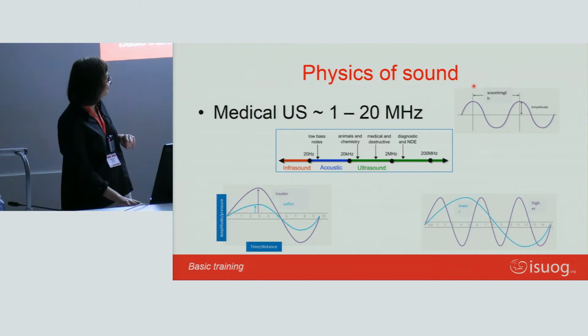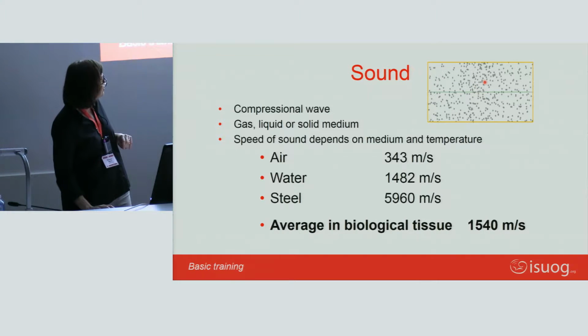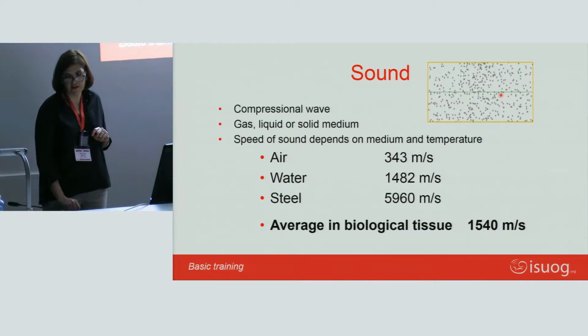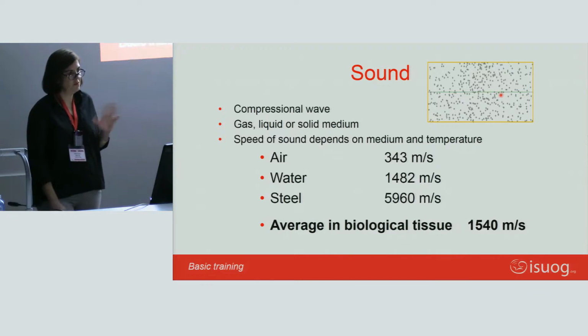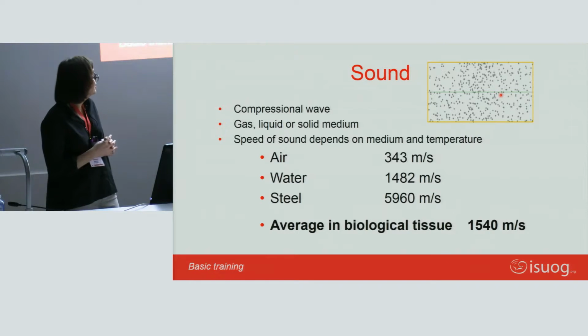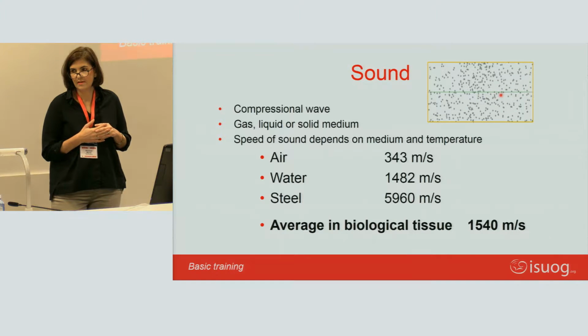We are supposed to have some animation here, some moving images. Well, on the picture on the right here, these little dots are meant to be moving, and they represent molecules moving, and that essentially is what sound is. Sound is the movement through a gas, a liquid, or a solid.